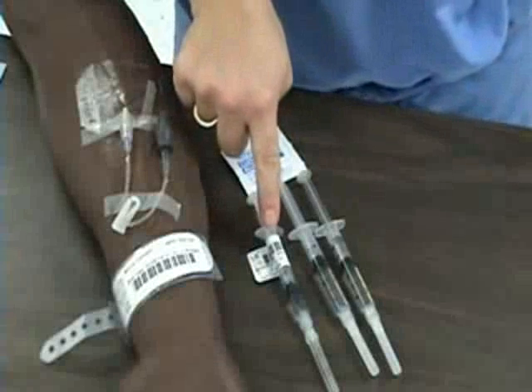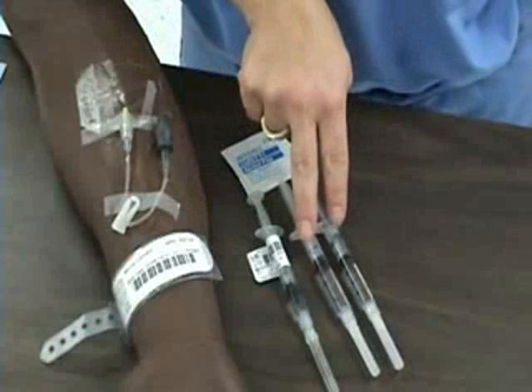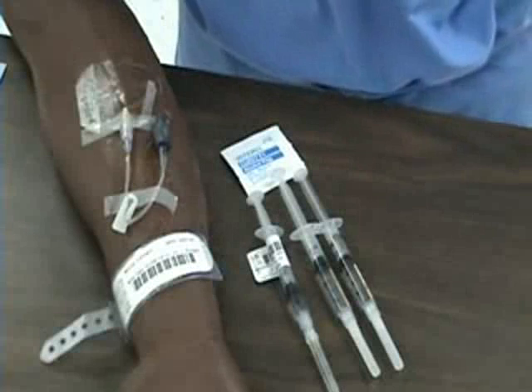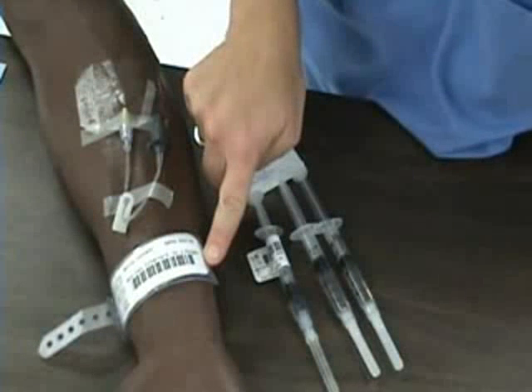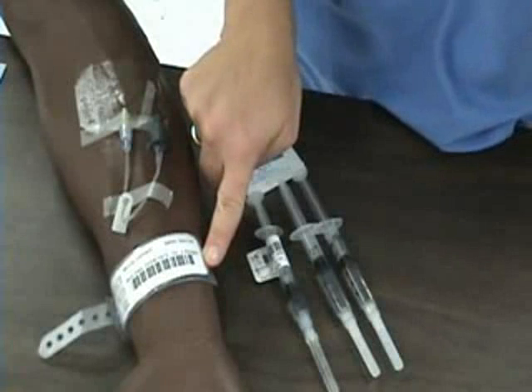I will first gather my supplies. I need my syringe with my medication, an alcohol prep, and 2 pre-filled saline flushes. I will enter my patient's room, wash my hands, introduce myself to my patient. Then, while looking at his armband, I will ask the patient to state his name and date of birth. I will ask the patient if he has any allergies.